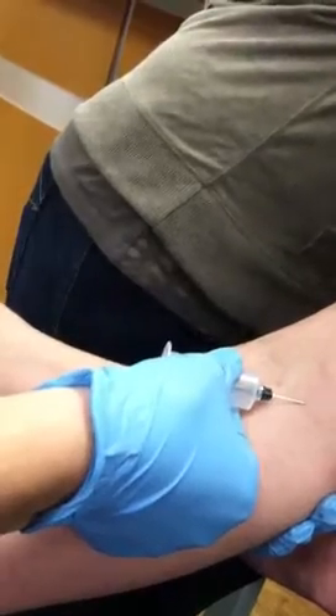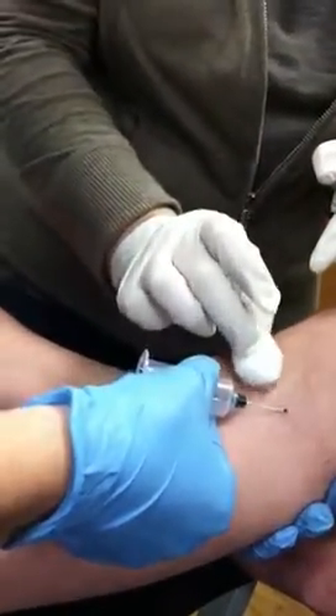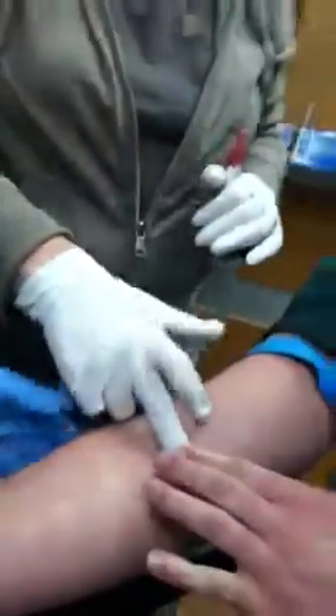Don't you have to put counter pressure? Counter pressure after the needle's out — so pull the needle out. And then apply pressure. Yay! Good job, Becca! It's okay, it's okay. Thank you.